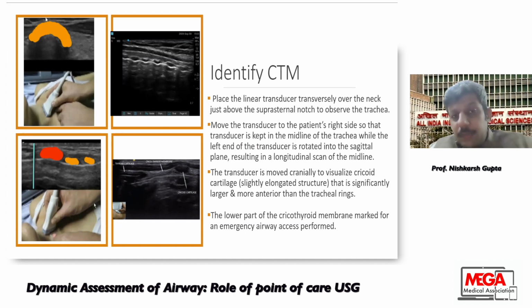But many times it becomes difficult to identify the cricothyroid membrane, especially in those with a thick neck and a lot of fat tissue, or where the neck has had radiotherapy or burns, and you may not be able to identify the cricothyroid membrane.